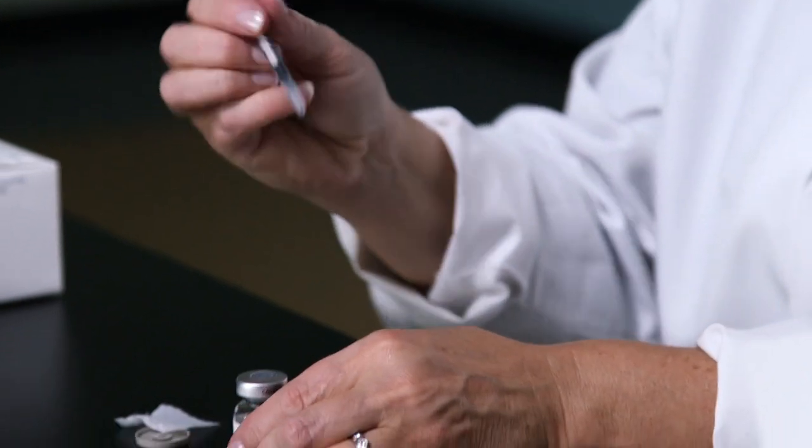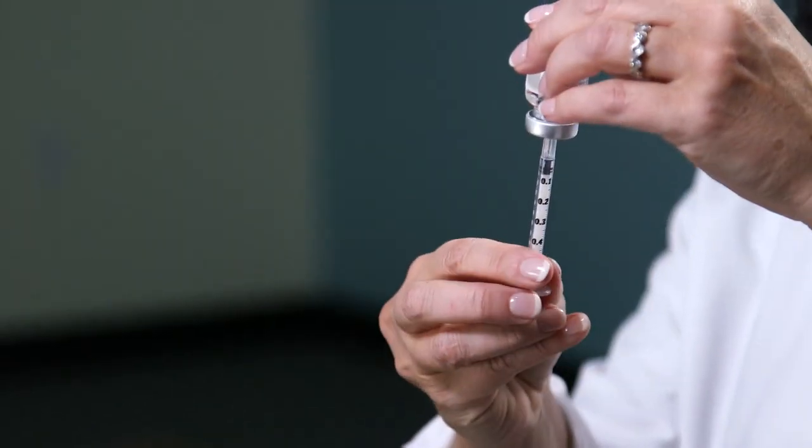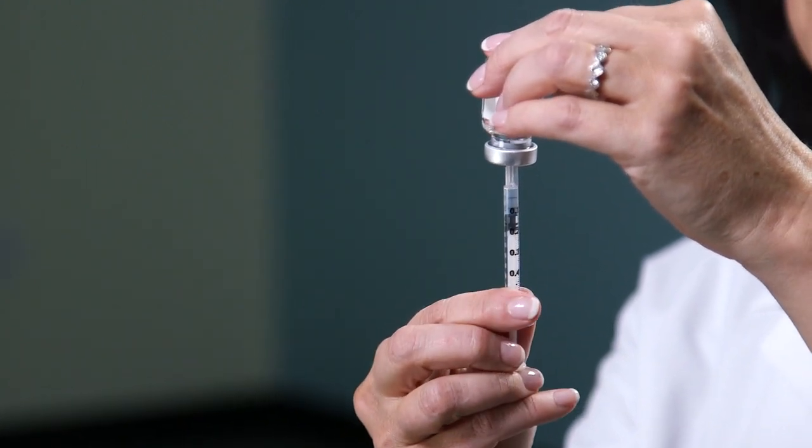Remove the cover. Place the needle through the rubber stopper. Inject the air in, and then pull back the plunger to your prescribed dose.